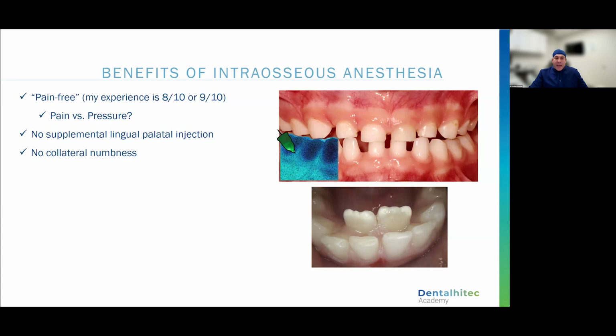I have not had, to my knowledge, one patient that has had collateral numbness via an intraosseous injection in my practice since I started. We don't have to give bilateral blocks. That's one of the most uncomfortable things, I think, for a patient. What happened to me all the time before I was able to give intraosseous anesthesia is that I would treatment plan one side and have them come back for another side. You don't have to do that anymore.